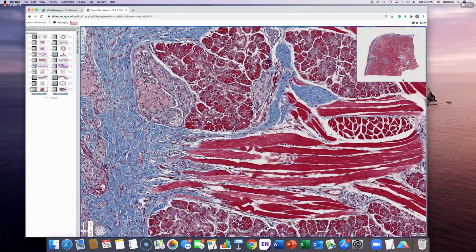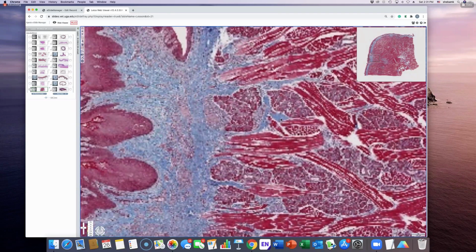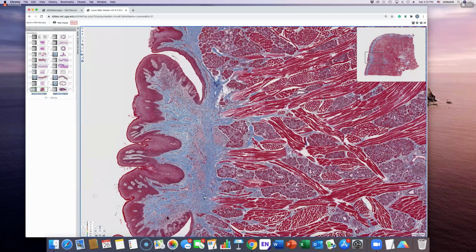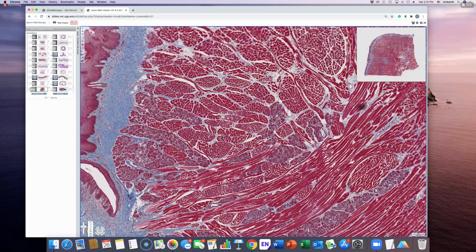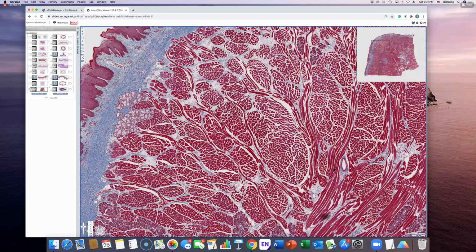So if we zoom out, see, there is one type of salivary gland here, right? If it has all this red cytoplasm, then it's probably producing a watery proteinaceous secretion. But if it's paler like this one, the cytoplasm is paler, it's producing a mucousy secretion.